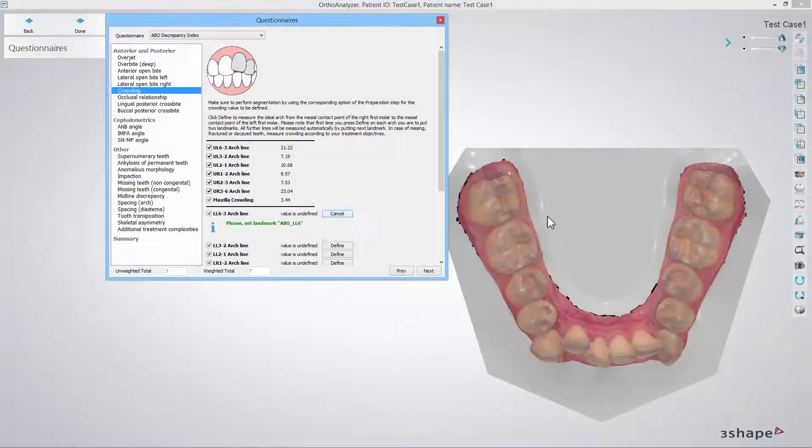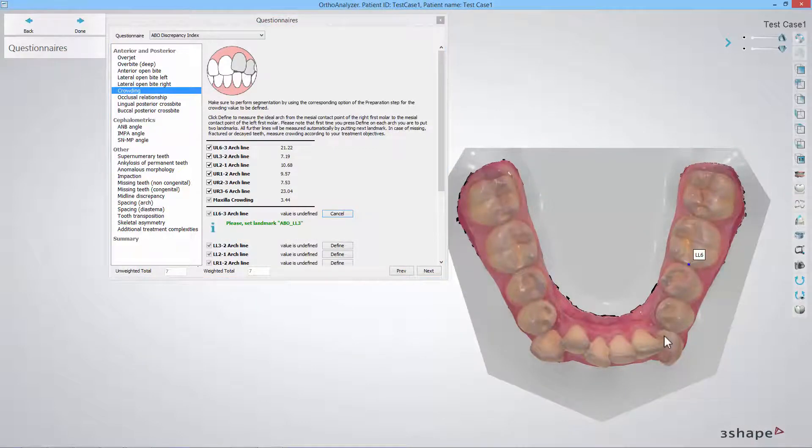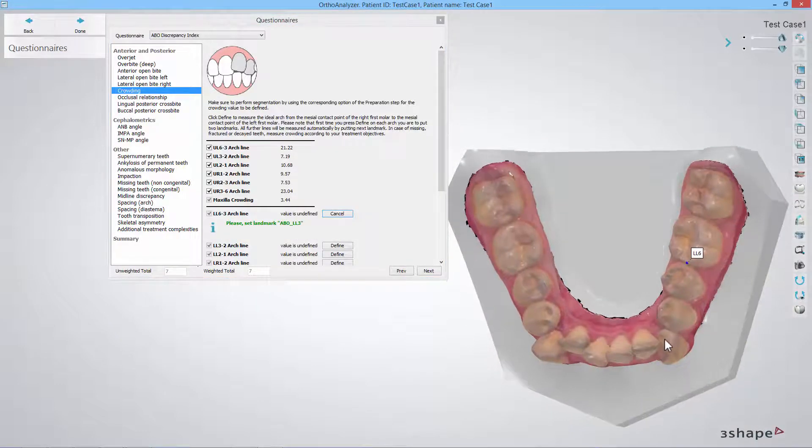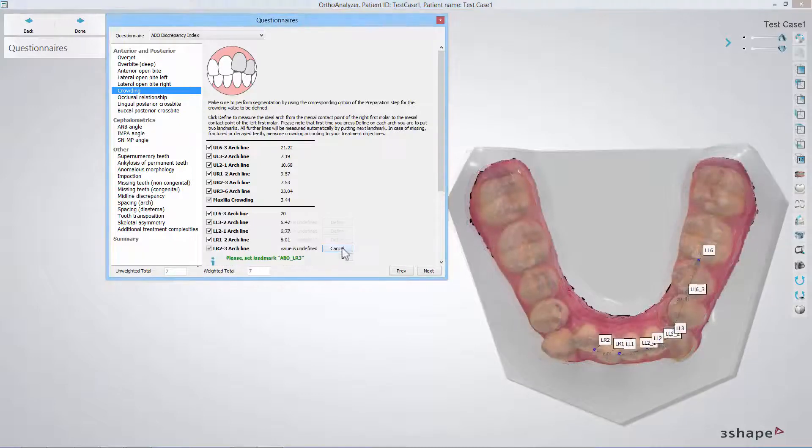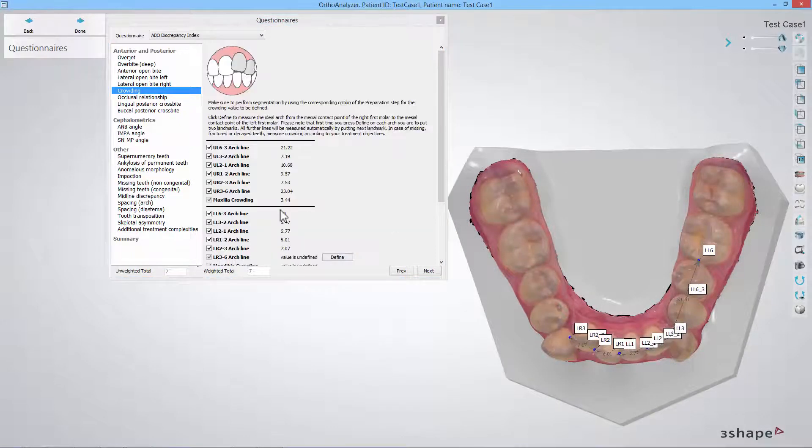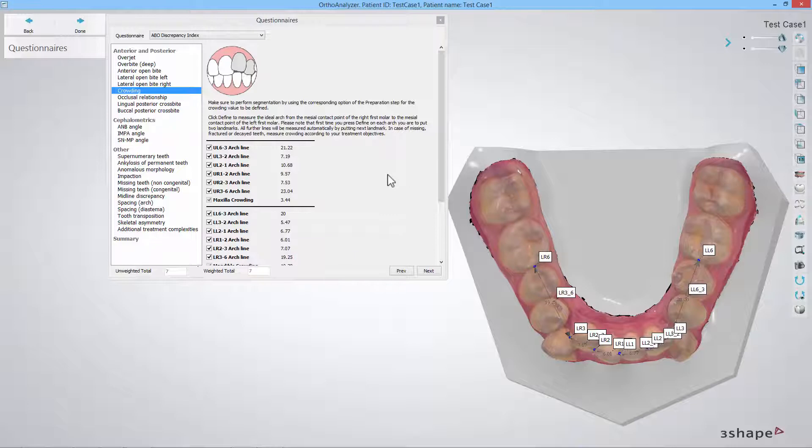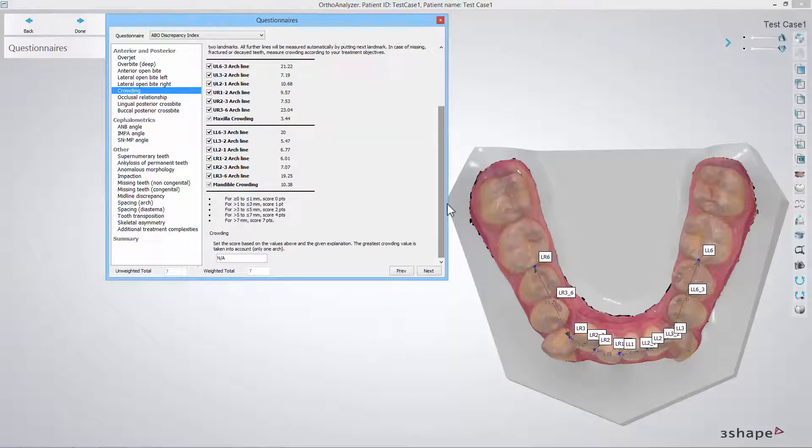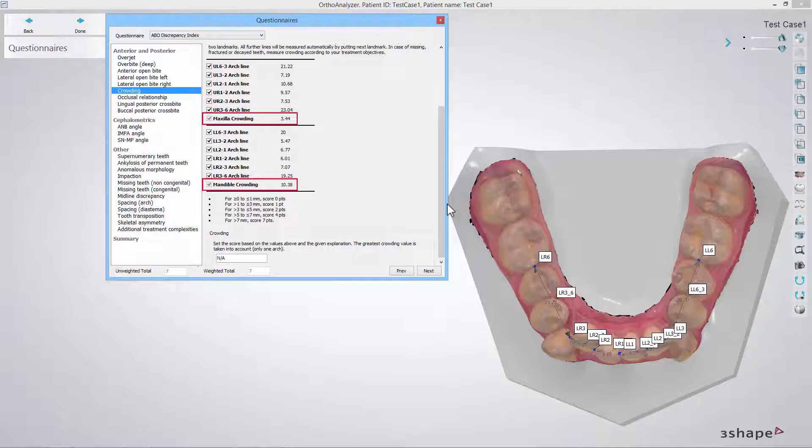Then do the same for the mandible ideal arch. Now when you're done both the maxilla crowding and the mandible crowding values will be shown based on your ideal arch and the segmentation data.